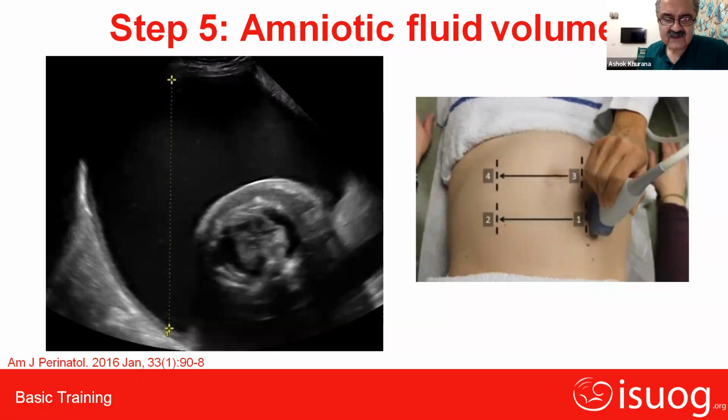And then there is a very nice, straightforward clinical question on whether there is any relationship between AFI and fluid amount and volume. We must understand that all of these things that we have spoken of today are directly related to the amniotic fluid volume, and therefore we are using them as indices. So the deepest vertical pocket, as well as the amniotic fluid index, are related to the amniotic fluid volume, but the volume is difficult to calculate because even 3D is not efficient in doing so, and therefore we use them as an indicator of amniotic fluid volume. Of course, there are people, even in our own group, with such a reasonable amount of clinical acumen that just by putting a hand on the fetal abdomen, we can say yes, there is increased or decreased liquor. But ultrasound takes you into a more objective evaluation of what is going on.